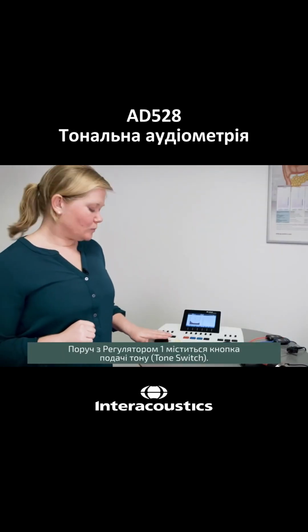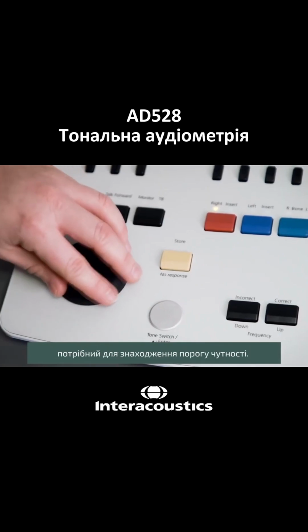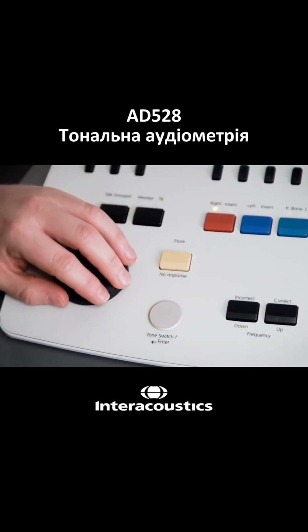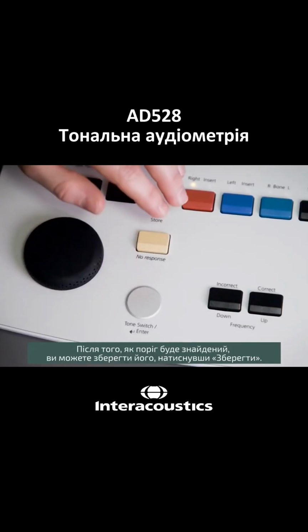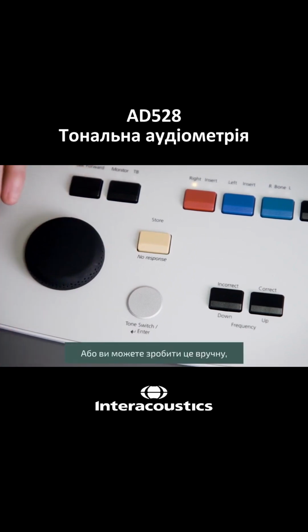Also around wheel 1, you have the tone switch so that you can increase and decrease the level until a threshold is found by presenting the tone to the patient, pressing the tone switch. When a threshold is found, you can store the threshold by pressing store. The device itself will then automatically jump to the next frequency, or you can do it manually.